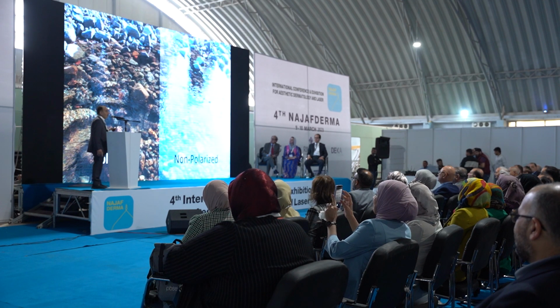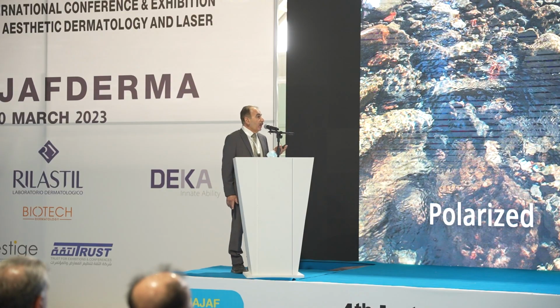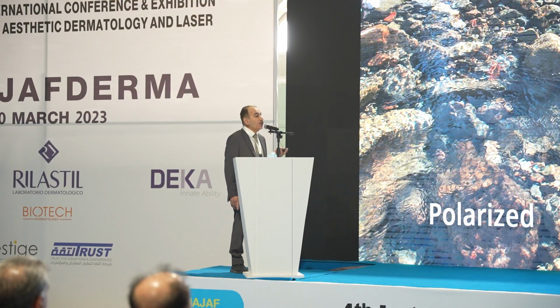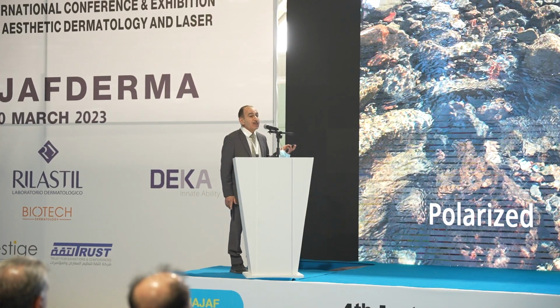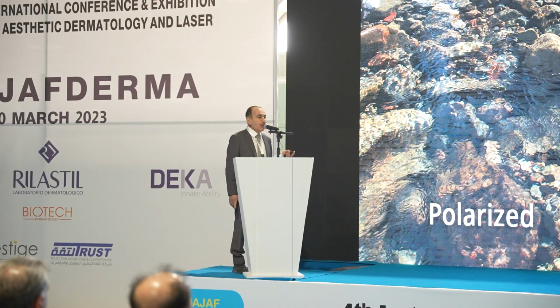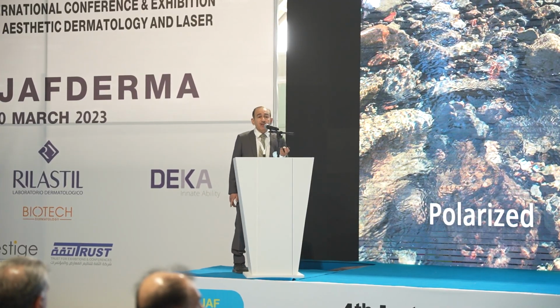The same principle is applied to dermoscopy. Dermoscopy will get rid of the reflection on the surface of the skin, on the stratum corneum, and will let us look through it into the deeper parts of the skin, so that we can see things inside the lake, not only on the surface of the lake. What are the things that we are going to see when we get rid of the stratum corneum and the surface of the skin? What are the things?